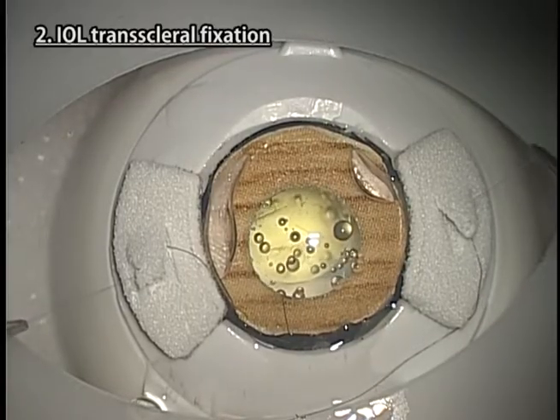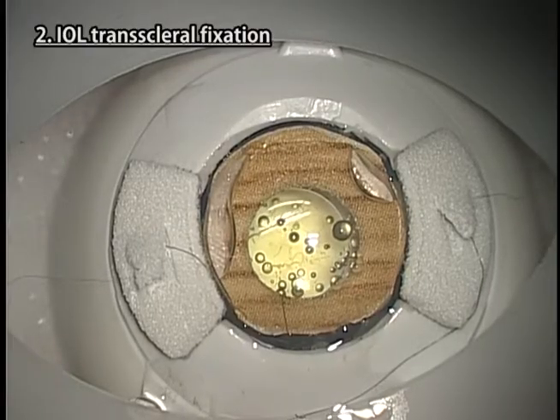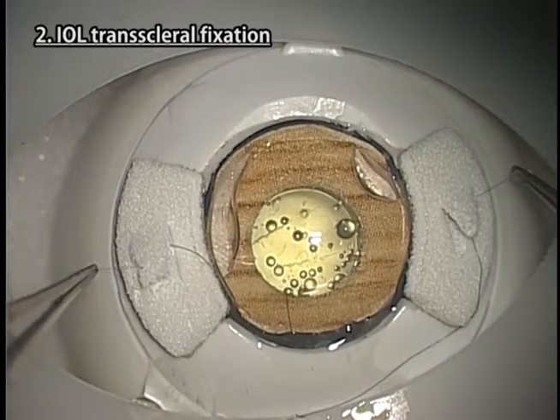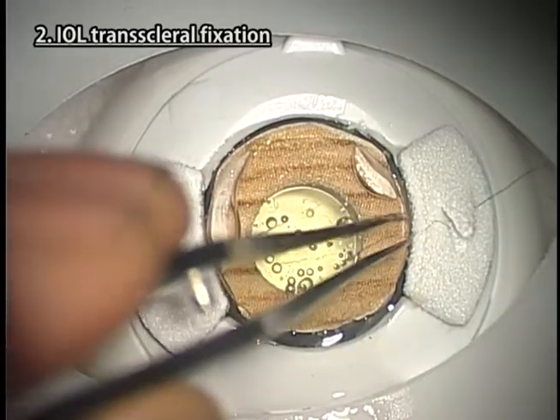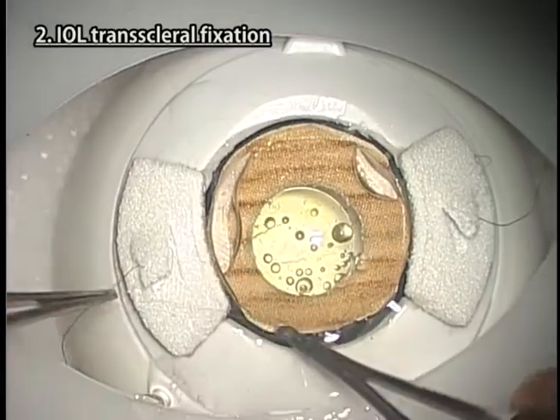You cannot practice the actual treatment of the vitreous. You can only practice going through the motions using a vitreous cutter. It is advisable to use 9-0 suture with needle rather than 10-0 suture, because 10-0 suture can easily be snapped during manipulation.